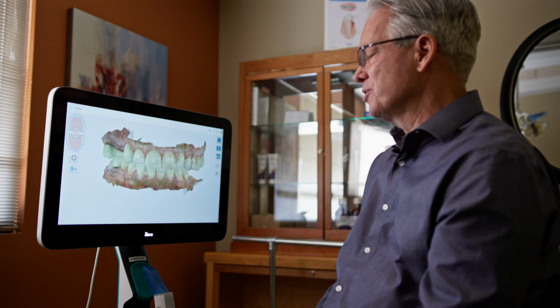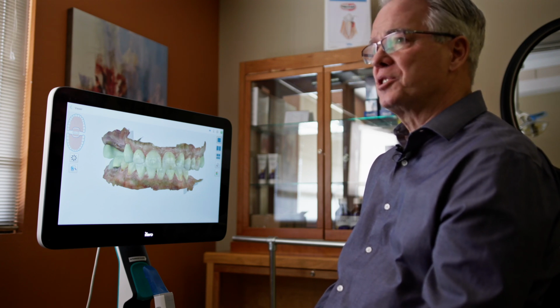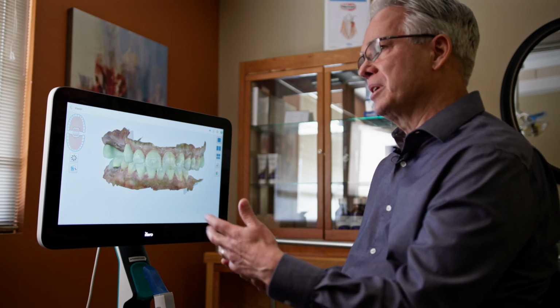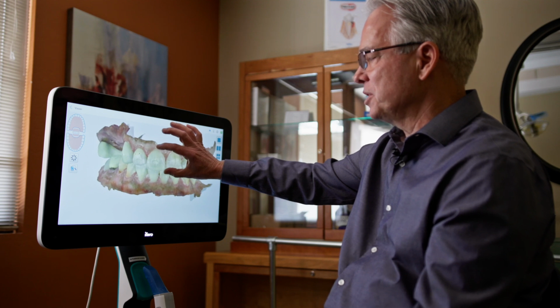I tell you, when I first saw it, I couldn't believe it, because we've used photography in dentistry for a long time, but now that we have a live video image, we can manipulate the image to make it more visible to patients. So for example, here are some images of this patient's teeth, and patients have never really seen their teeth in this view before. They just kind of see the front teeth.